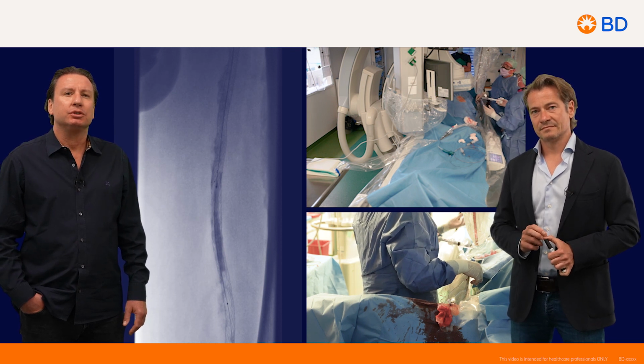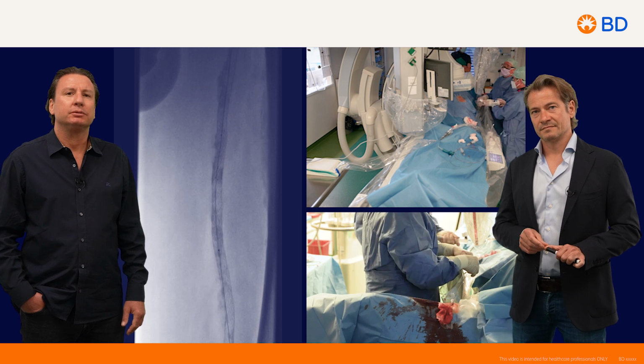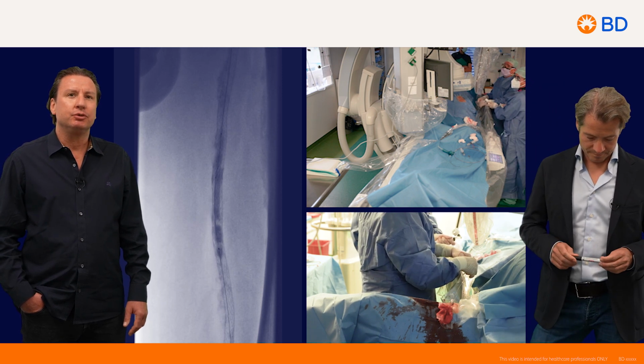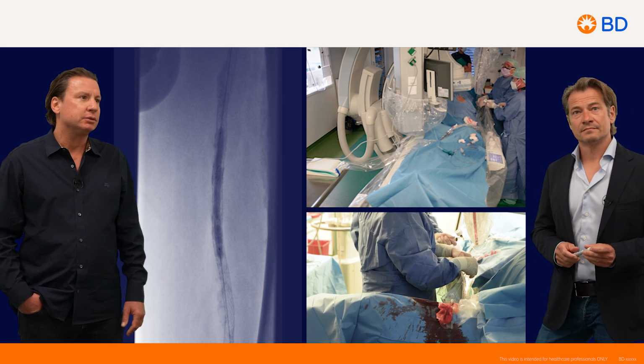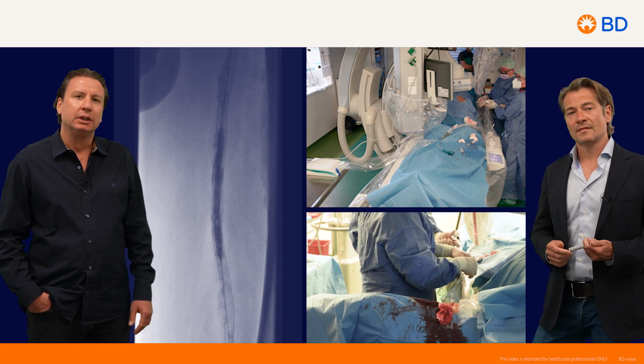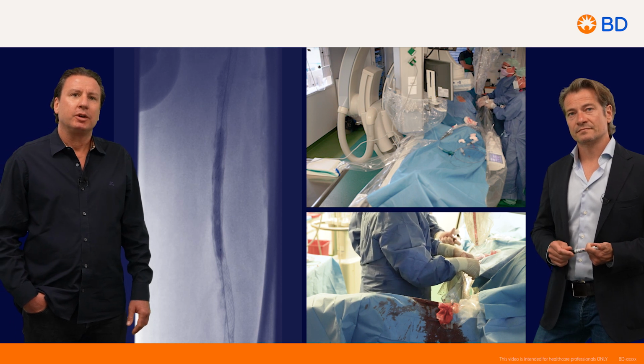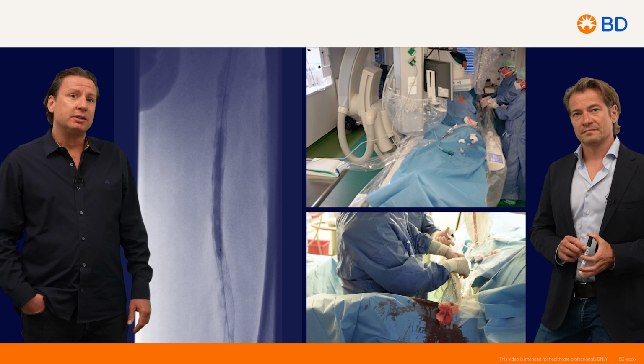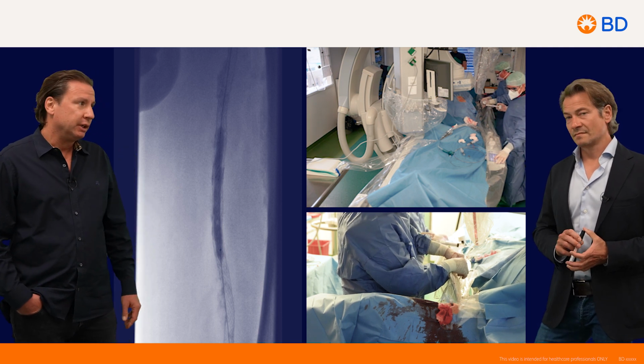Before the application of the Rotarex, only here. Approximately, we just use the Rotarex really to be able in the stent to remove as much material as possible. So again, here, this would be also a nice case for 8 French Rotarex.